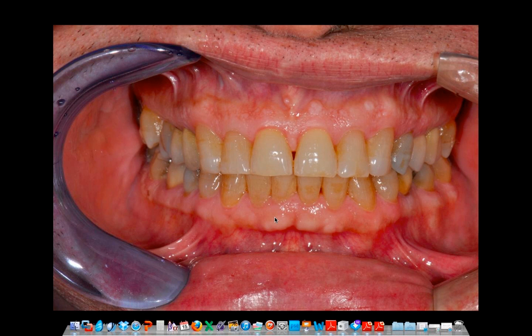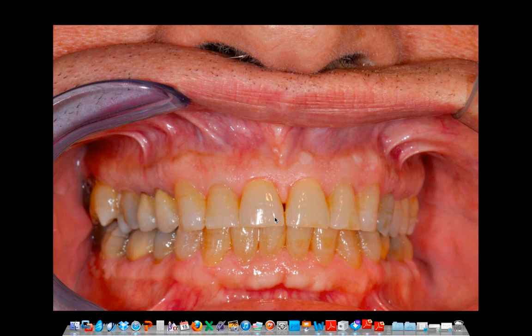So you see this? Not a bad shot, but the person just needs to come in closer. It's a little wet, but if they got in closer from second molar to second molar, you'd see things better. Notice the pathology above the central and above the cuspid. Nice to be able to diagnose that. So again, if you're getting a shot that looks like this, not bad. Just get in closer. That's important to keep in mind.